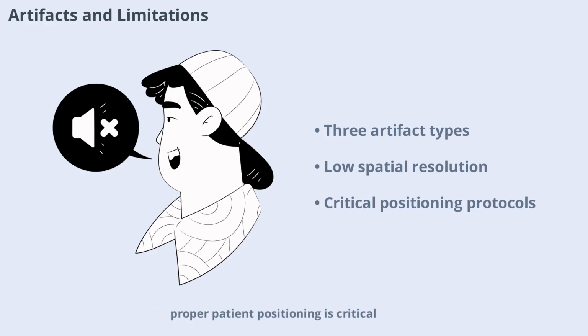Additionally, proper patient positioning is critical. Even slight deviations can significantly degrade image quality, making accurate interpretation more difficult.